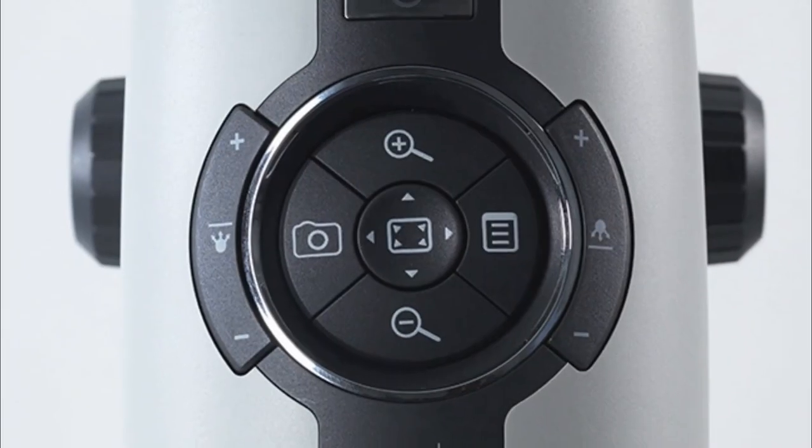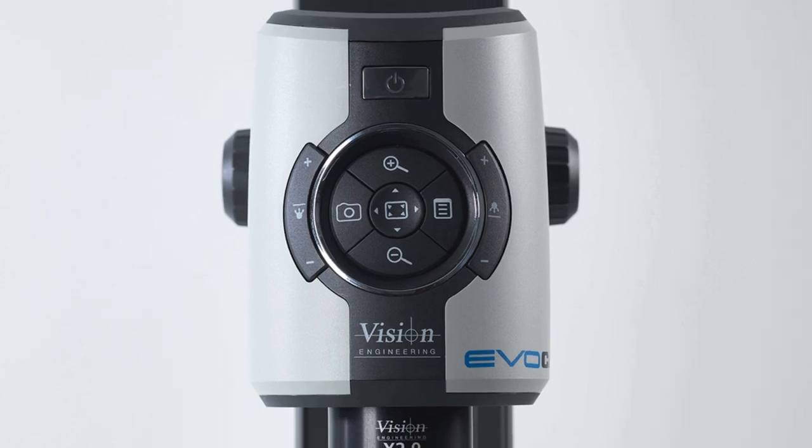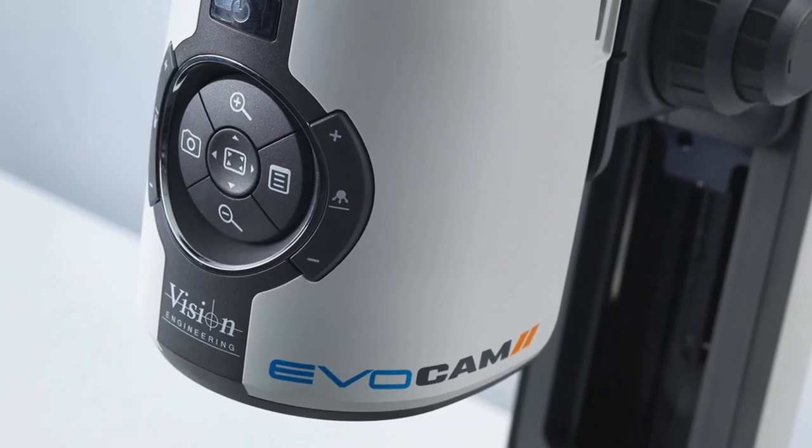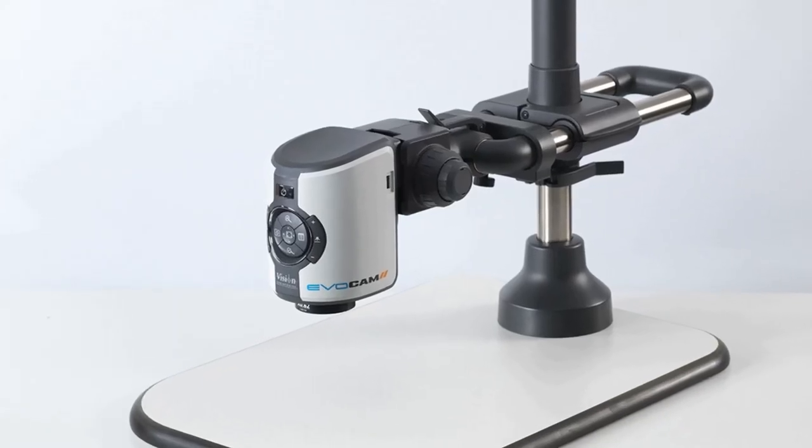Hi, I'm Gary Elm, and today we're reviewing the Vision Engineering EvoCam 2 system. This is our EvoCam 2 — it is a digital inspection system using a 30 to 1 zoom. It's a full HD system running at 60 frames a second.